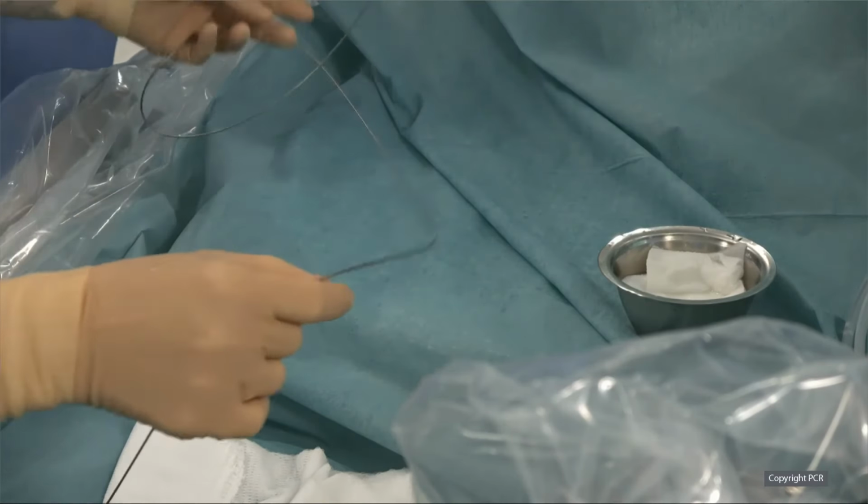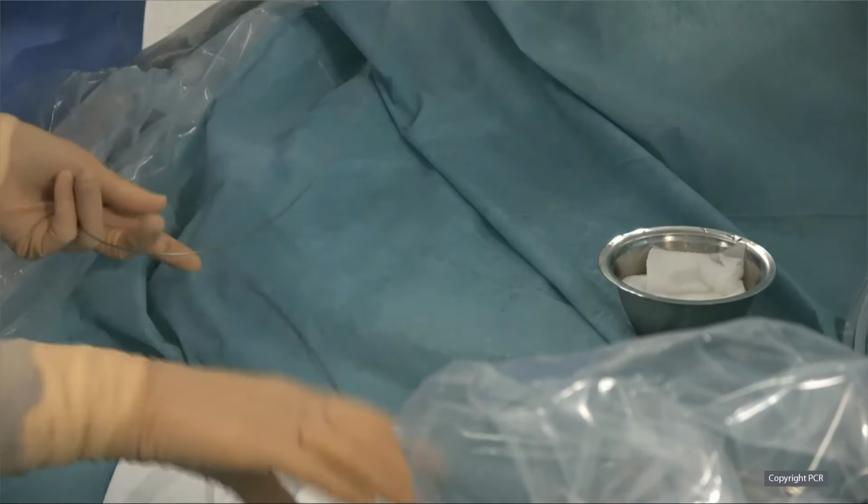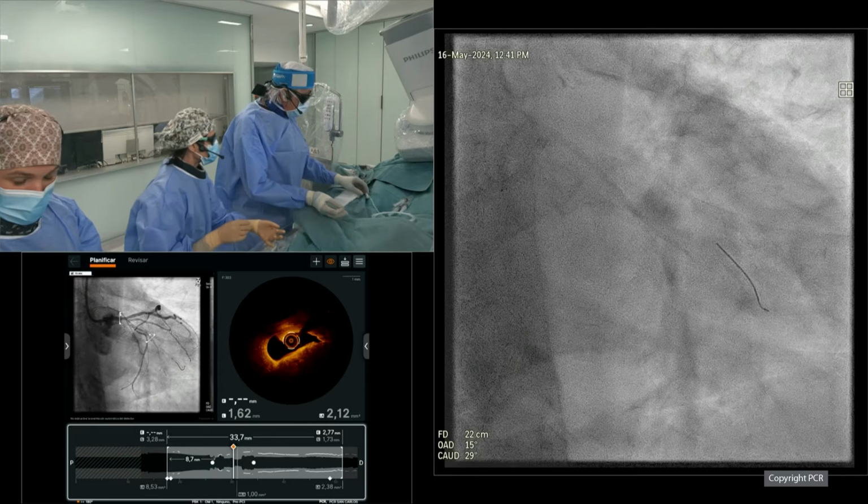One important thing about the fluid is that you need to ask every patient about allergies. Well, the measurements, the sound. So you will see it in a second. Nieves will help me here.